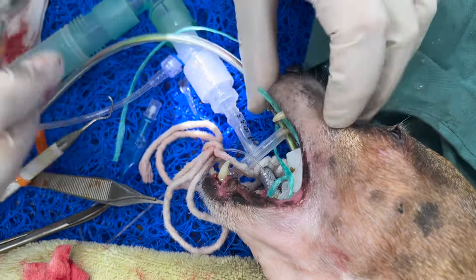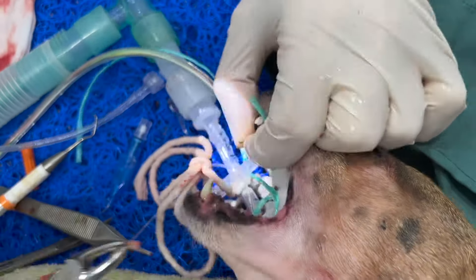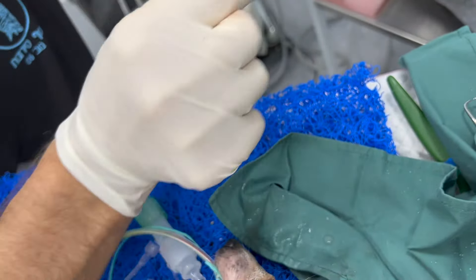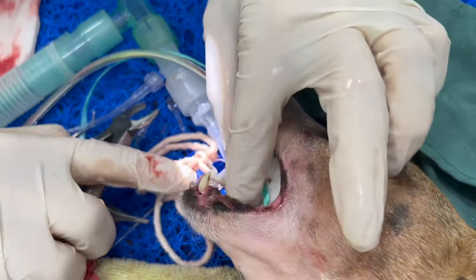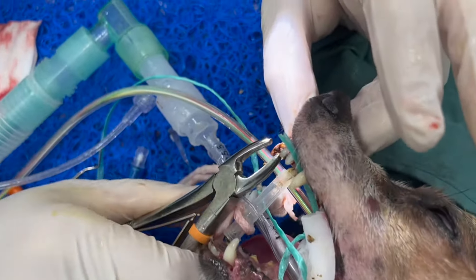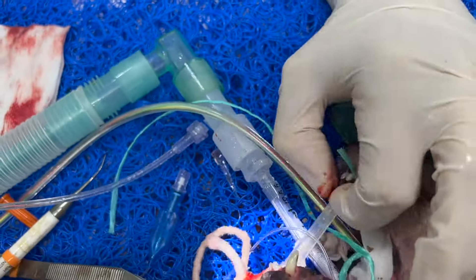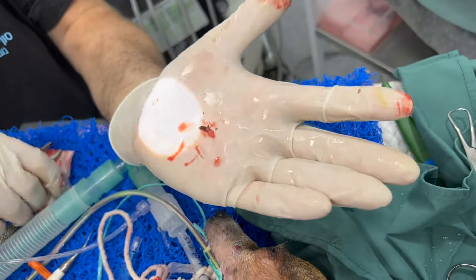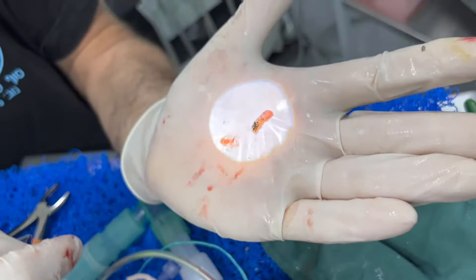When teeth are really loose like this, the tooth will just come out. And there it is — a complete drop. That's a tooth that's pretty damaged and comes out beautifully. You can actually see a bit of an abscess on top of the tooth — it's called a periapical abscess.